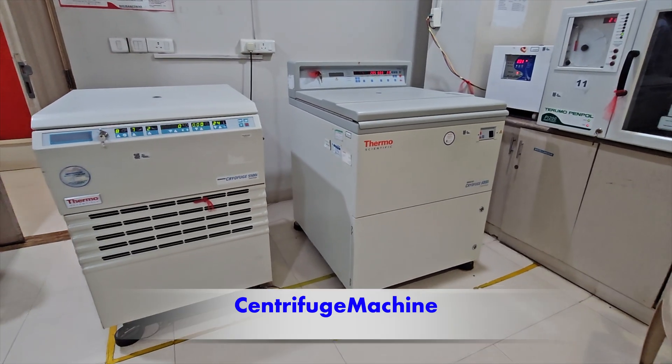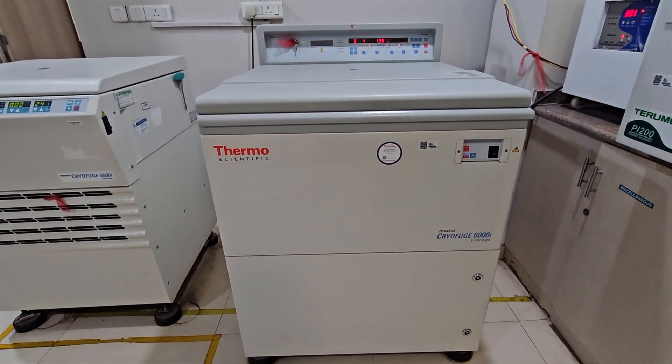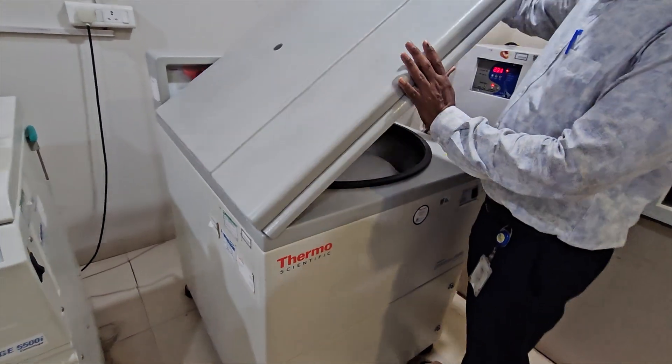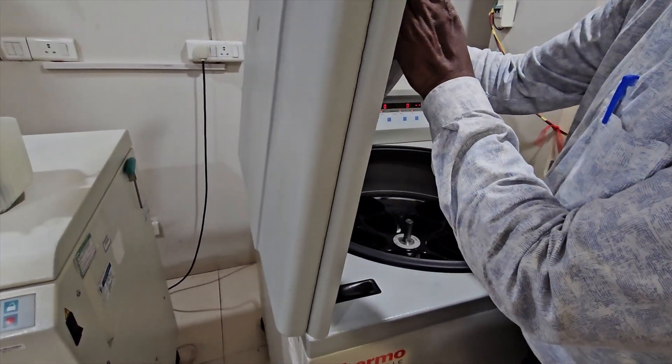The blood components are separated in the centrifuge machine. Blood is spun at high speed so that the heavier red blood cells and the plasma are separated.